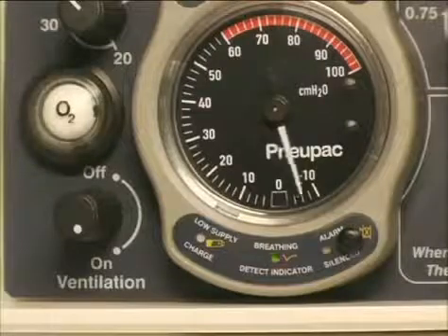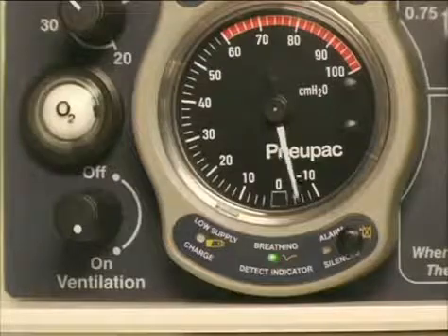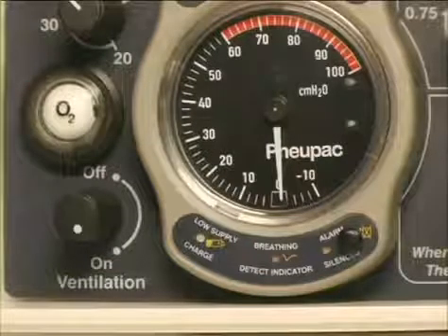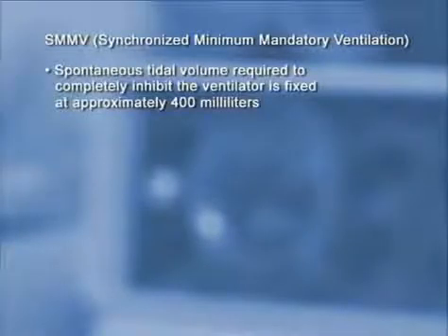The ventiPAC ventilator can detect spontaneous breathing by an adult patient and limit ventilation accordingly. If breathing is adequate for an adult, ventilation ceases. If the patient requires ventilation to supplement breathing, the ventilator interposes ventilations synchronized with the patient's efforts. One of the main features of this ventilator is the Smiths Medical patented technology called SMMV, or Synchronized Minimum Mandatory Ventilation. The spontaneous tidal volume required to completely inhibit the ventilator is fixed at approximately 400 milliliters.